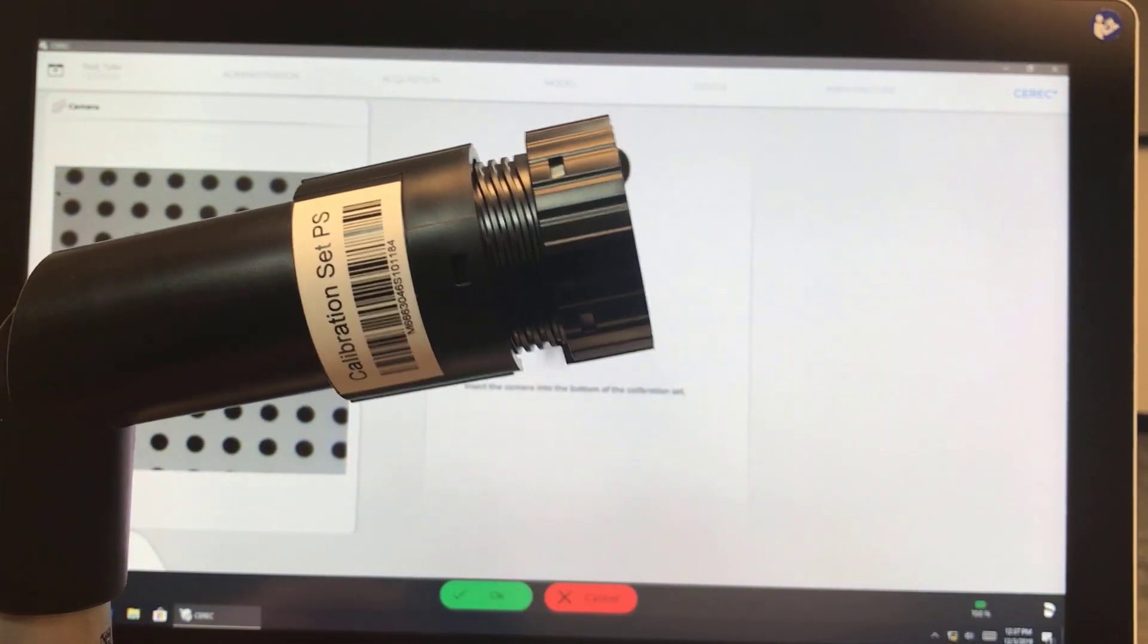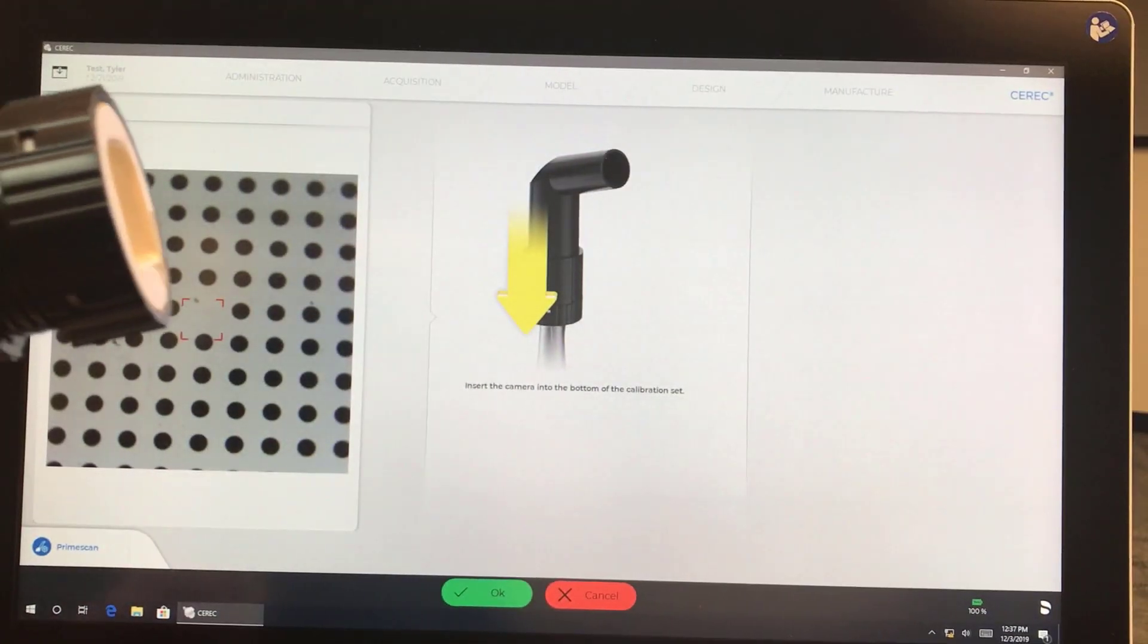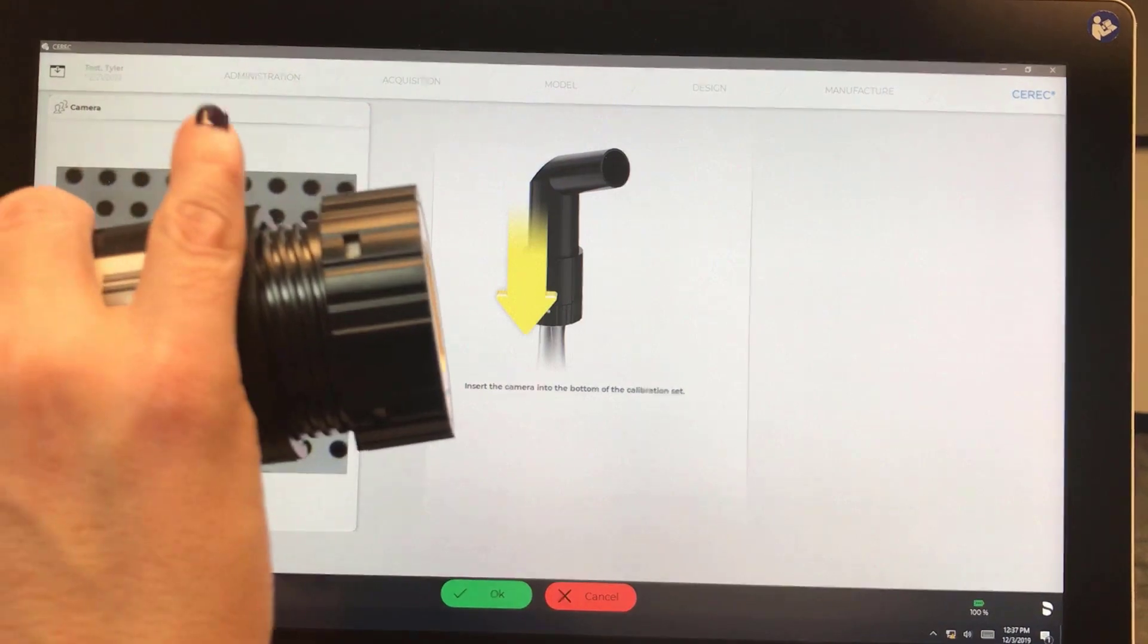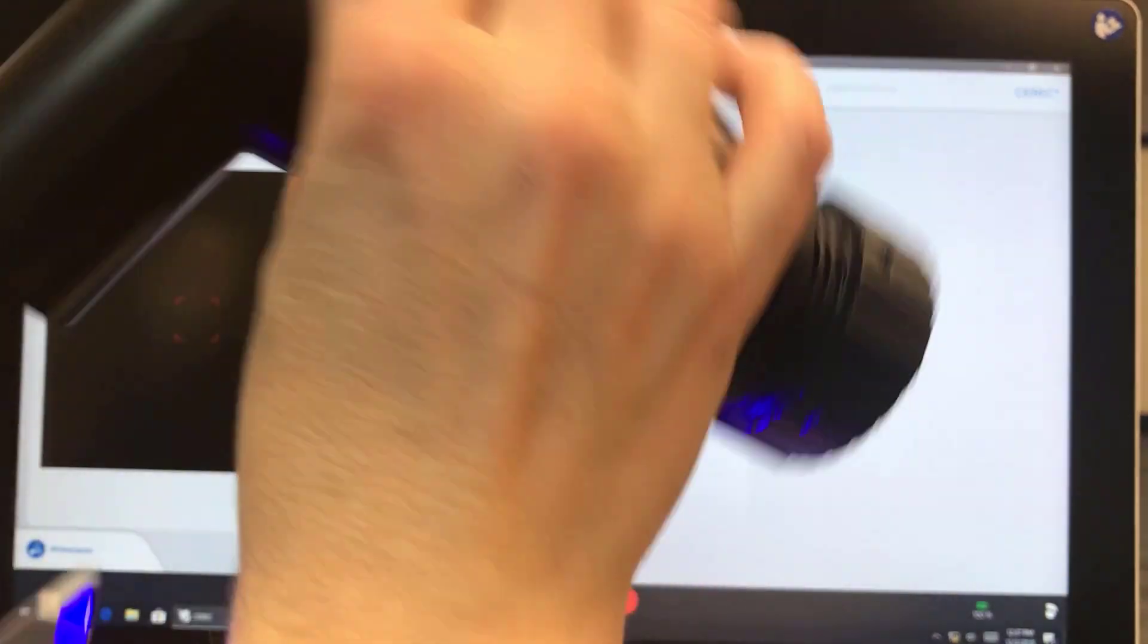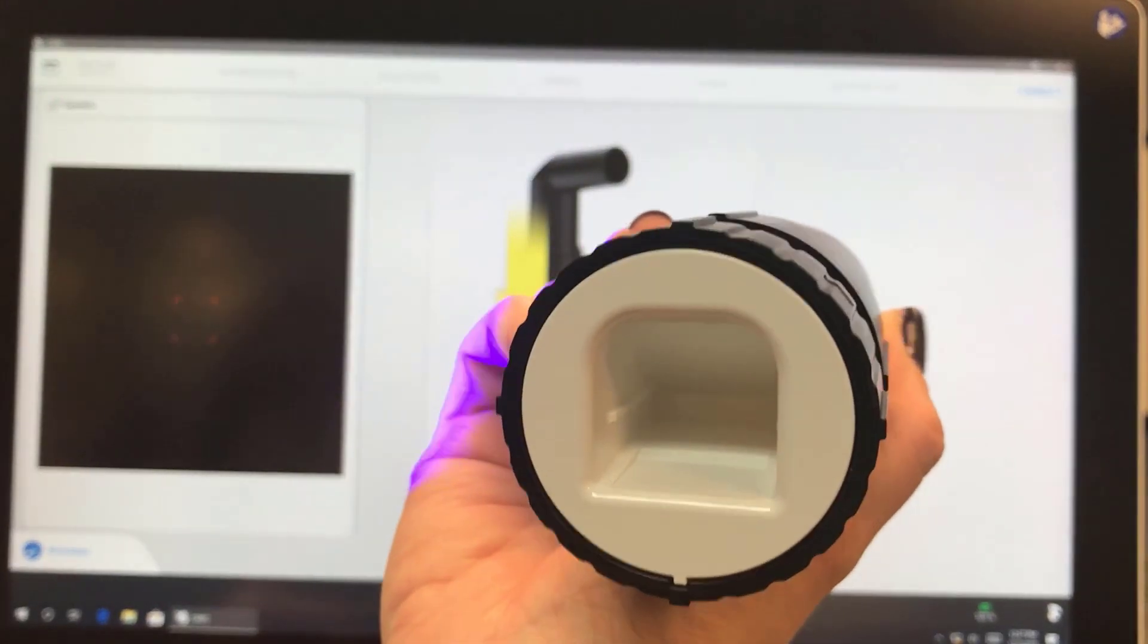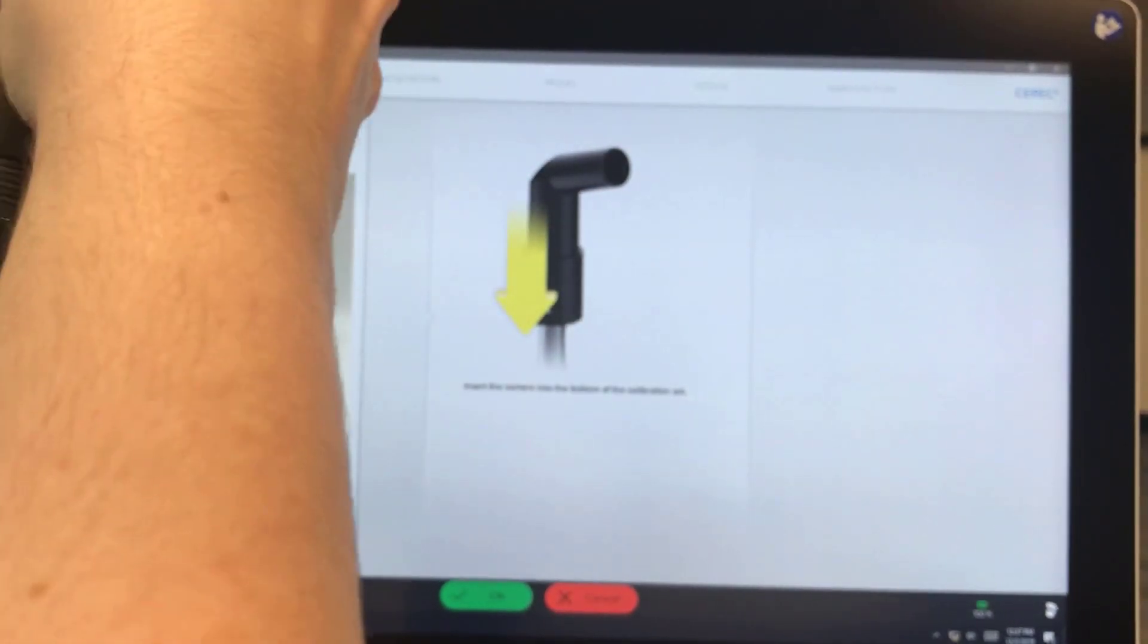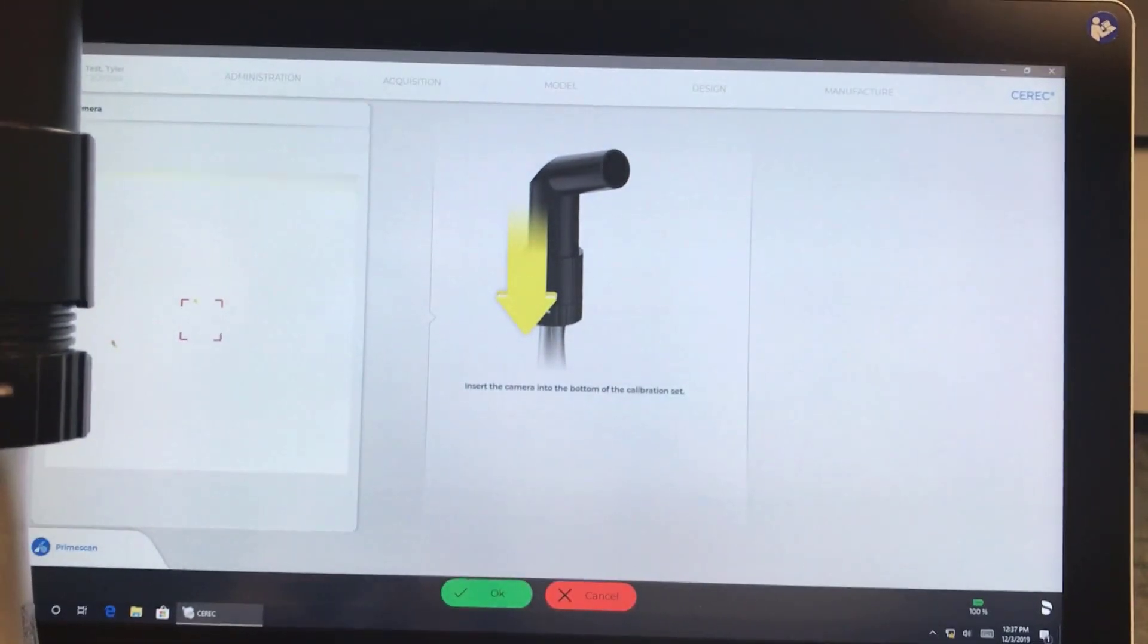Then it's going to prompt you to change the tool and position it in a different way. So we're going to insert into the bottom of the calibration set. Nice and tight. And hit OK.